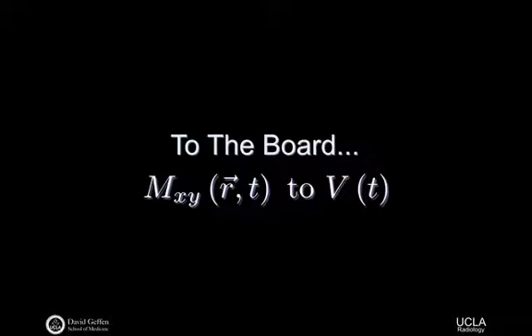It's proportional. During the time that we're actually sampling the signal, is it changing very much? We're only sampling the signal for maybe a millisecond or a couple of milliseconds, a pretty short period of time. And so our Mz magnetization during the time that we're detecting that flux, recording that voltage, is really just proportional to some initial condition, maybe some Mz. It's kind of constant. It's an assumption that we make because we're not sampling the magnetization for very long.